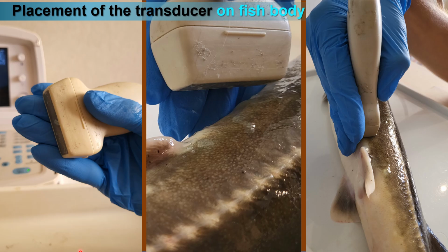The transducer is taken with the open palm, so that the fingers protrude over its lower edge for 1 to 3 centimeters. The hand with the transducer is placed on the fish so that the finger pads protruding behind the transducer fit tightly to the abdomen and the vertical axis of the transducer is perpendicular to the body surface. As you move the transducer along the fish's body, the fingers also remain on the abdominal side, which helps keep the position at the edge of the torso and the angle of the transducer unchanged.